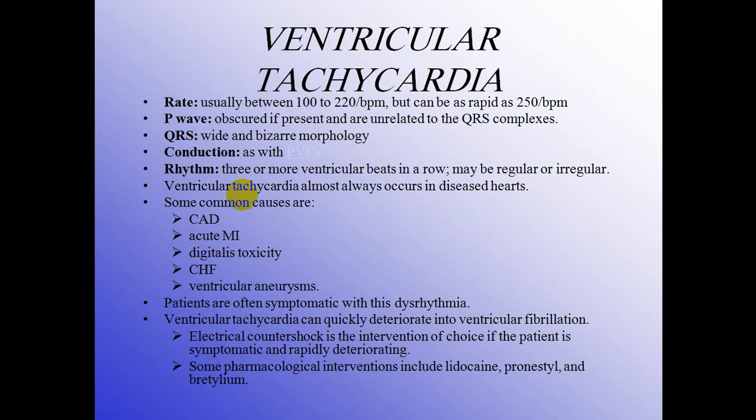Coming to the first serious rhythm, which is called ventricular tachycardia. The rate is usually more than 100, often more than 200 beats per minute, and can rise up to 250. P-waves are obscure, and if present are unrelated to the QRS complex, because the focus is a re-entry mechanism in the ventricle, so there is no P-wave.